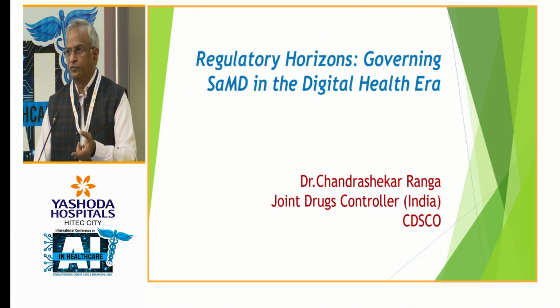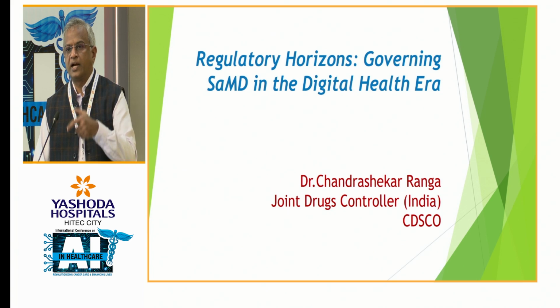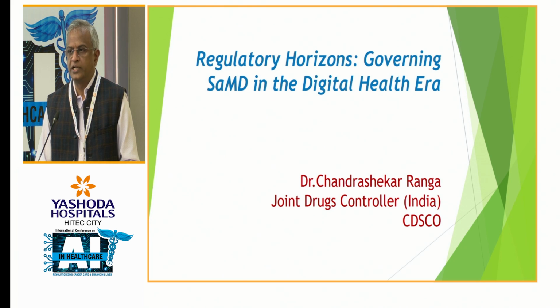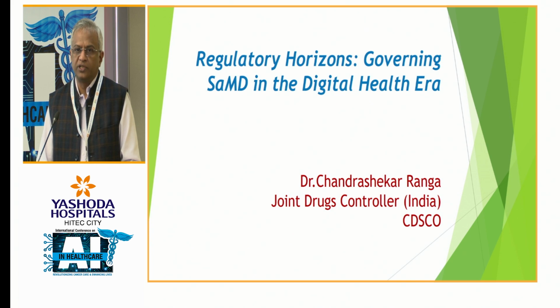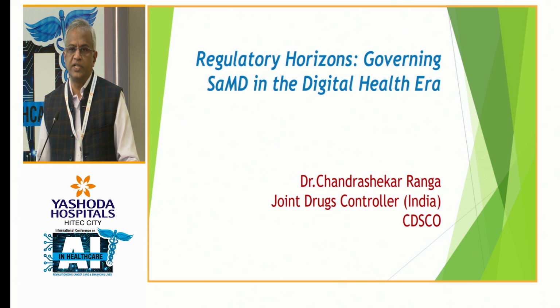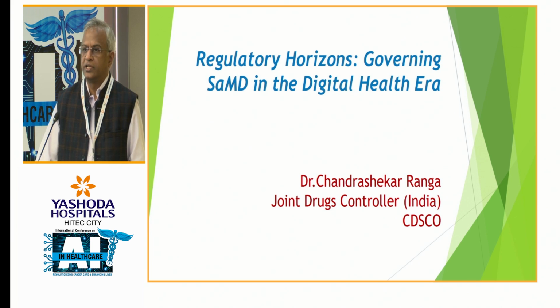For example, if we have a CT scan, even that has software, but those are called embedded software. They have a limited function. But in the case of a software as a medical device, the product itself will either diagnose, aid in treatment or monitor, or any of these which fall under the definition of the drug.